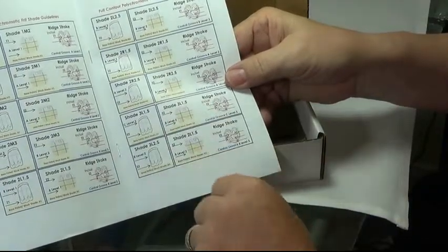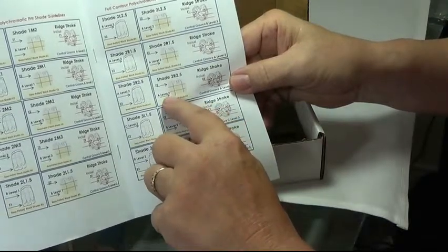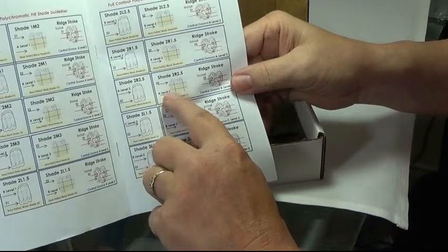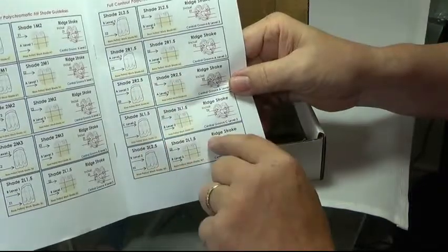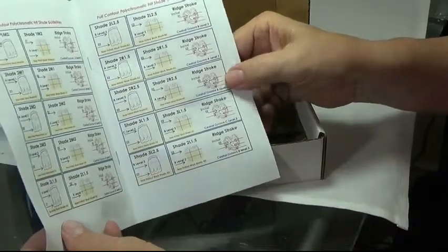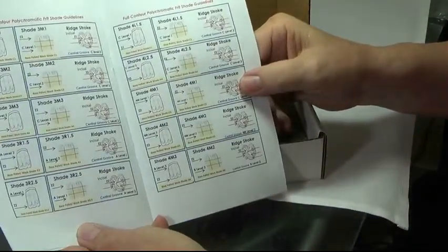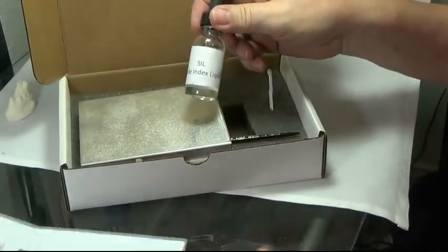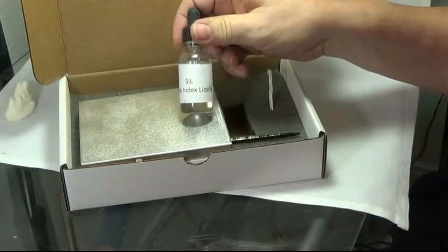With the 3D shades, we show you the block and the shade level off of your palette that comes in the kit, and the incisal color to match the incisal for this particular shade in the 3D. Every shade is completed in this booklet so you don't have to guess. We also have a special shade index liquid that allows you to see what the fired crown is going to look like.